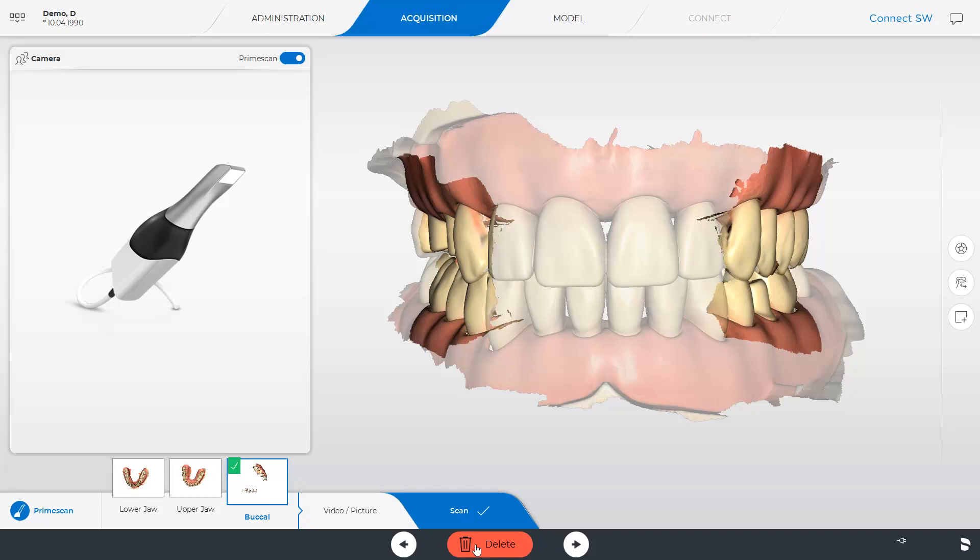A bilateral scan influences the allocation of the two jaws positively. There is no specific scan protocol necessary when scanning with prime scan. Detailed information covering the scan process can be found in our video tutorial on the topic of partial scan or full jaw scan with CEREC prime scan.